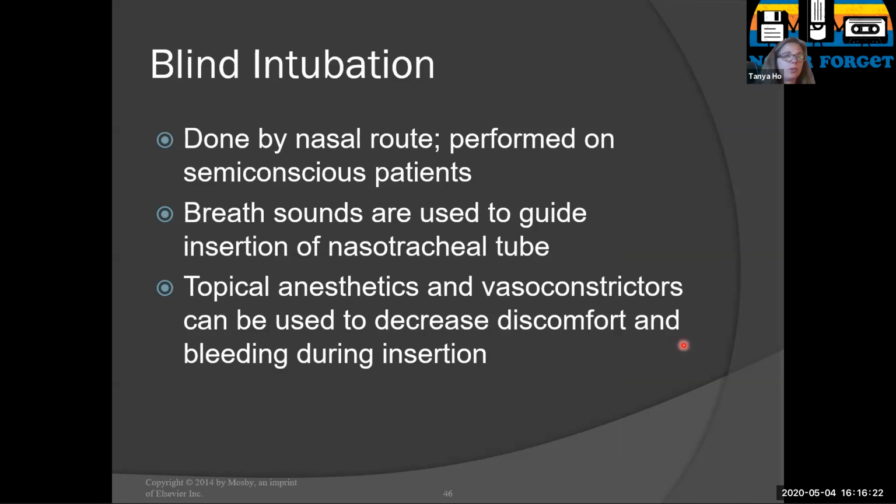Now let's say you can't use laryngoscopy for whatever reasons. A blind intubation could be done by the nasal route. Generally, they try to use breath sounds to guide insertion of the endotracheal tube, but blind pretty much doesn't work very well at all.